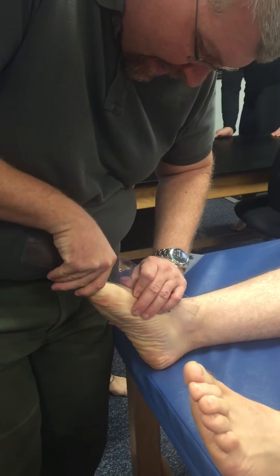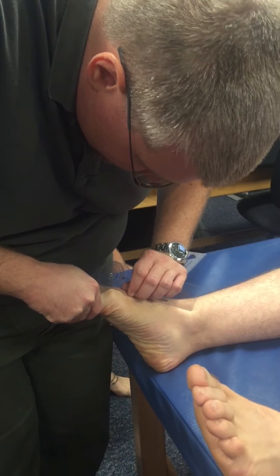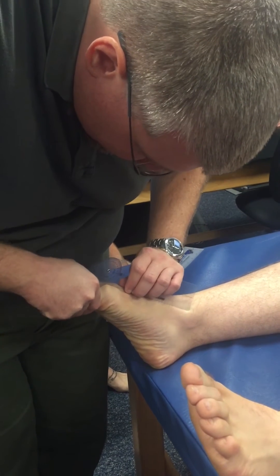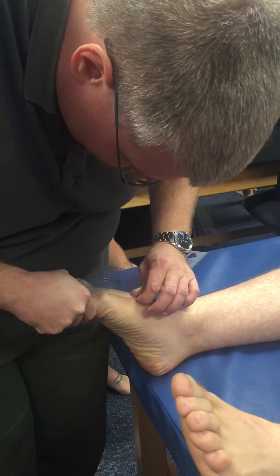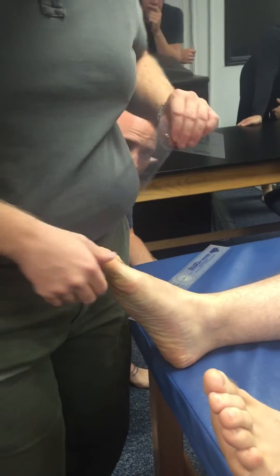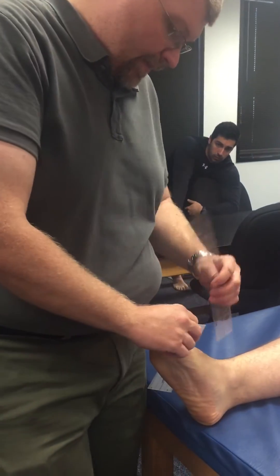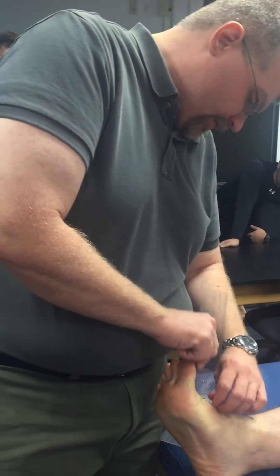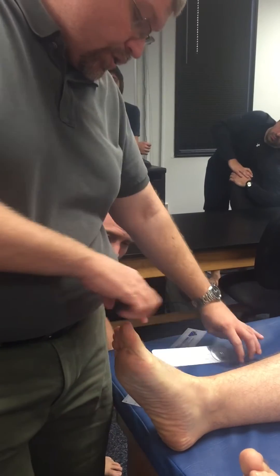It's very important that you have no gaps in between — the arms have to be parallel with each other. This arm has to sit on this bone, and this one has to sit on the proximal phalanx. Once I have that, I can take my number — zero to whatever the goniometer reads. Same thing for extension: they do it on top of the foot, going backwards.